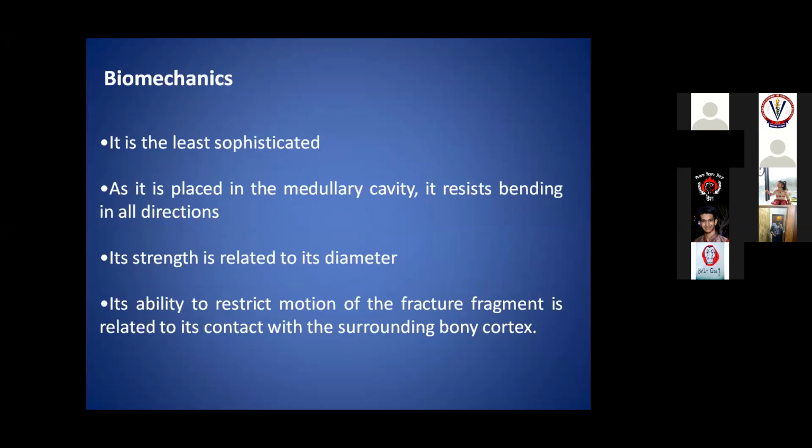So coming to its biomechanics, this we have also discussed earlier, that they can resist the bending forces. They are least sophisticated, and the strength is related to its diameter. So try to use a larger diameter pin, which should occupy at least 70% of the medullary canal of the long bone. Okay, that should be your criterion in selection of the size of a pin, and it will have the ability to restrict the motion at the fracture site.